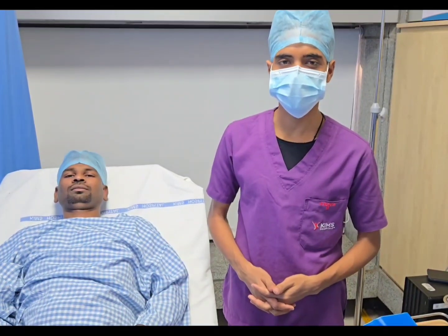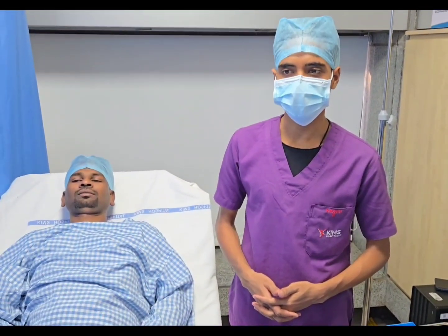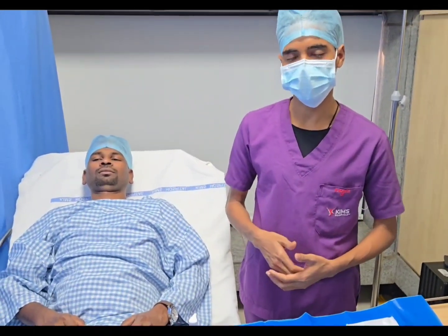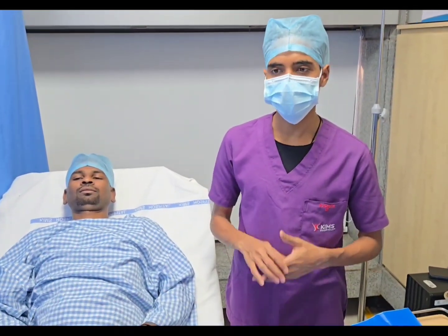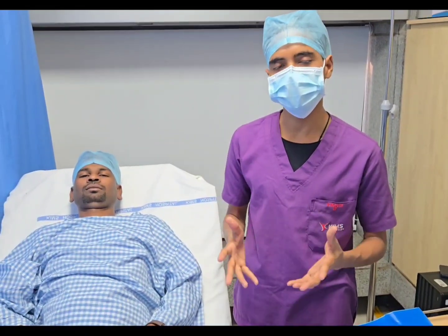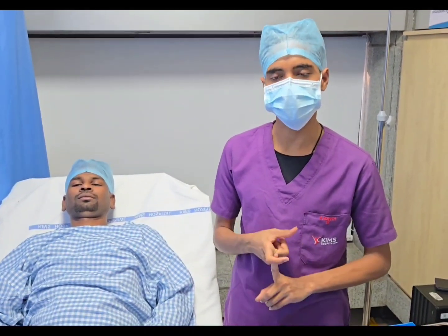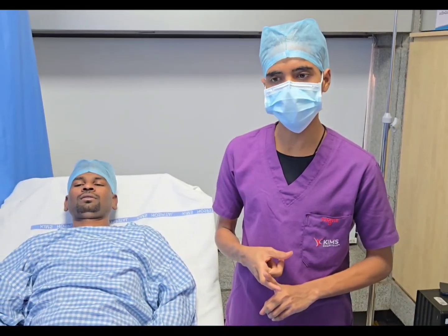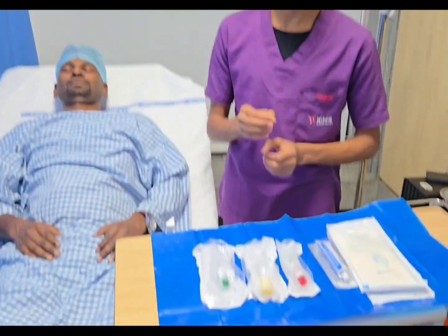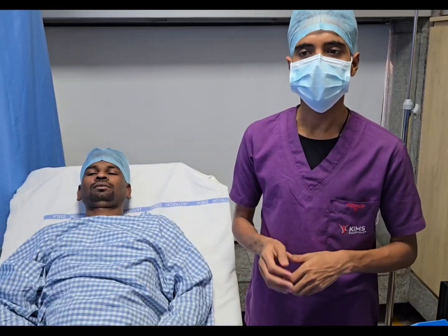Good afternoon everyone. Today I am going to deal with the topic of the oropharyngeal airway. The oropharyngeal airway, also known as the Guedel airway, is a rigid curved tube designed to keep the upper airway open. It is used for unconscious and unresponsive patients to prevent the tongue from covering the epiglottis. The indications are unconscious and unresponsive patients, upper airway obstruction and backfall of the tongue, to facilitate ventilation, and to prevent aspiration.